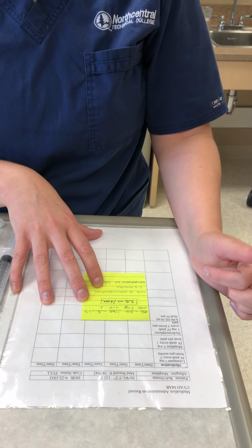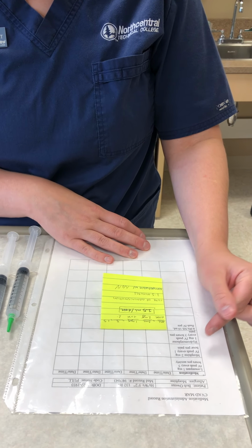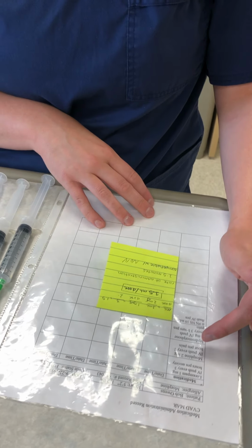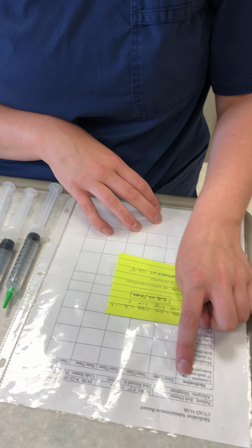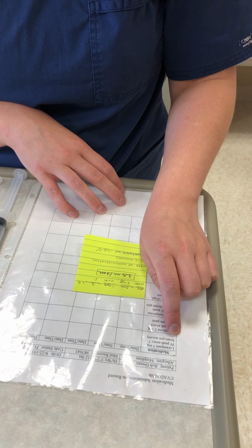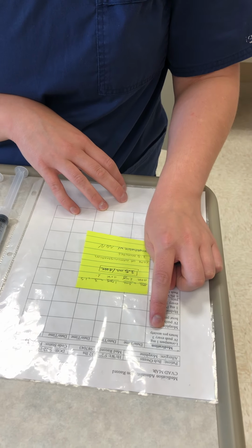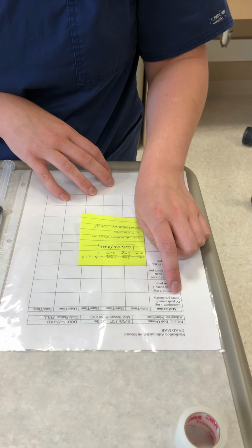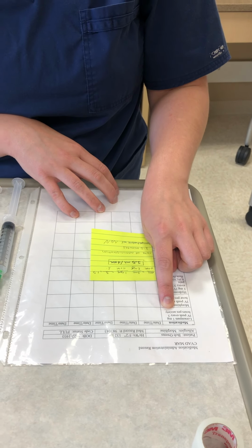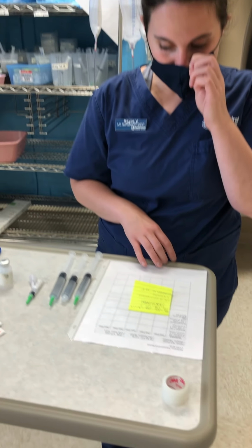that morphine is listed as a medication to be administered, but he has an allergy, so that's being changed. I do see here he has lorazepam, 1 milligram to be administered via IV push every 3 hours, PRN for anxiety. His last lorazepam he received was 4 hours ago, and he did just ask for more because he's feeling anxious. So I have my lorazepam.